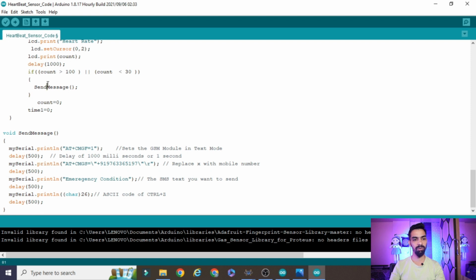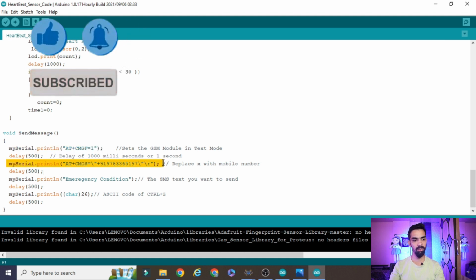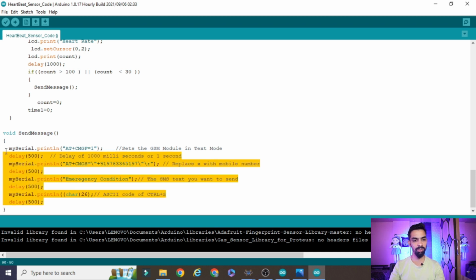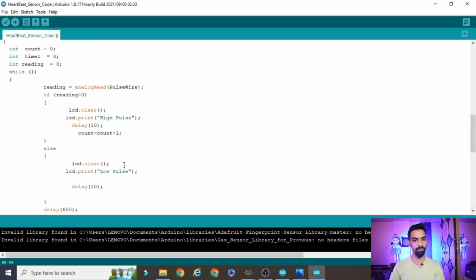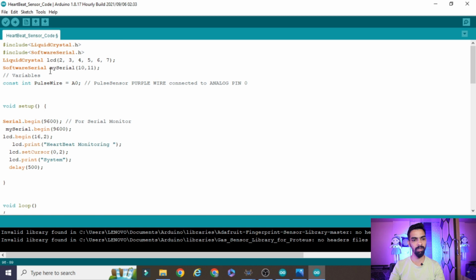To send the message, this function will be called, and this AT command will be sent to the GSM module line by line. You can see all my Serial print lines are nothing but the AT commands we are sending to the GSM module. So this is the logic to send the message. So our program is completed. I hope you understand the program completely.